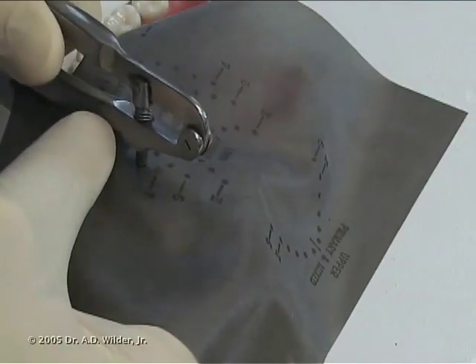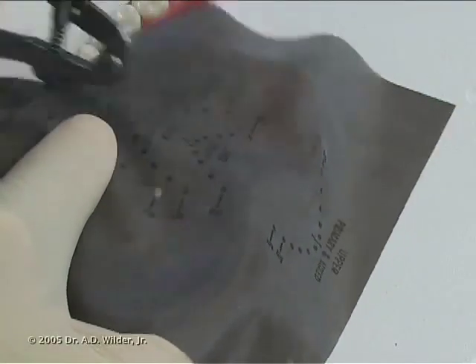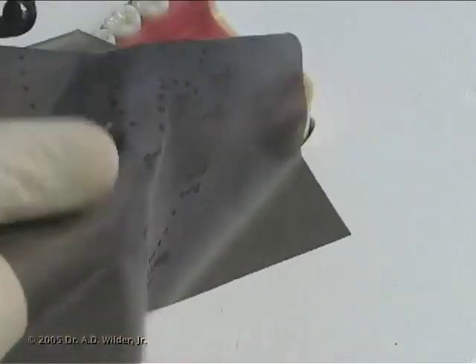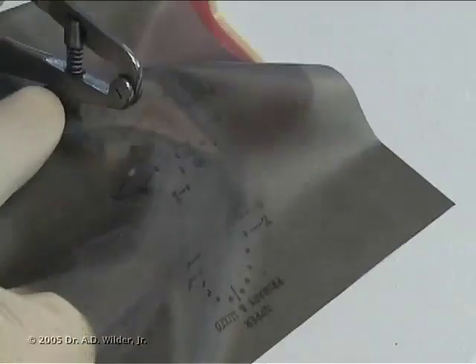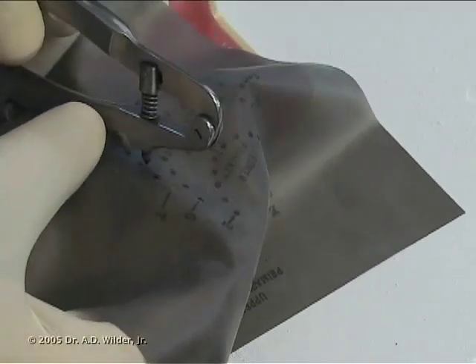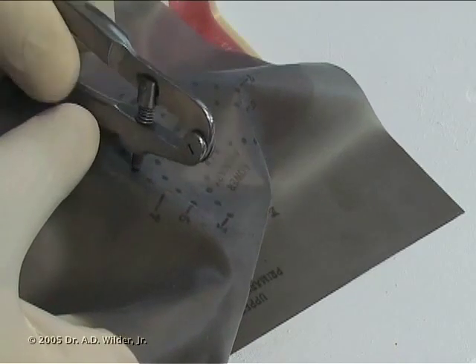Next, punch a hole in the rubber dam using a hole punch, selecting the right-sized hole for each tooth. You can use a stamp that marks where to make the punches for a given arch. Ensure that the punches go completely through the rubber dam.